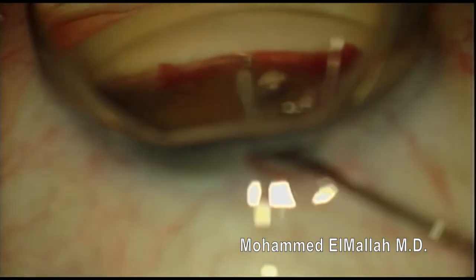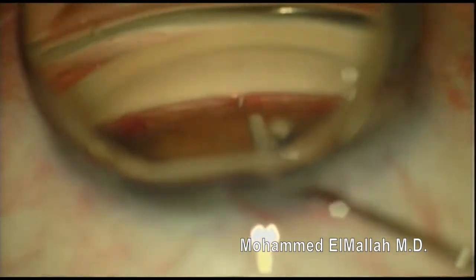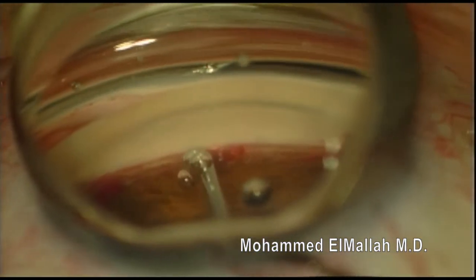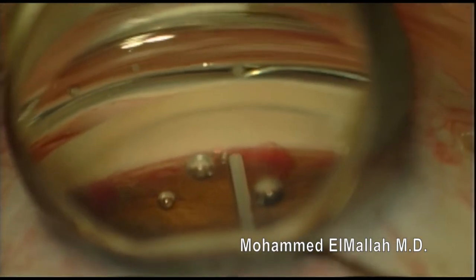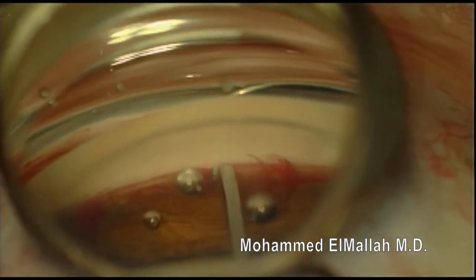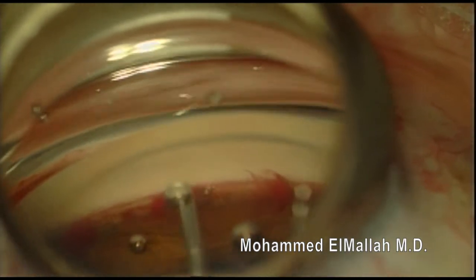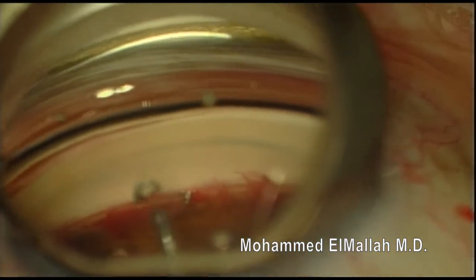So I get some viscoelastic, push the heme out of the way, re-center, re-focus, and get a good view. Unfortunately, the bubbles from the viscoelastic are not helping. I attempt to tap it back into place, but not too successfully. I push the bubbles out of the way so I can get a better view.